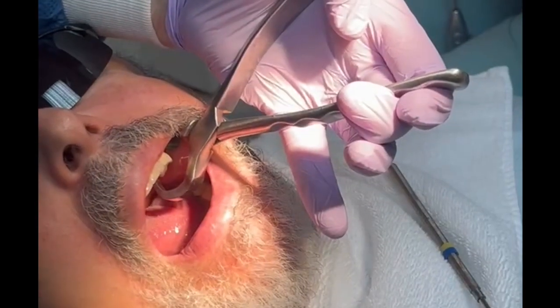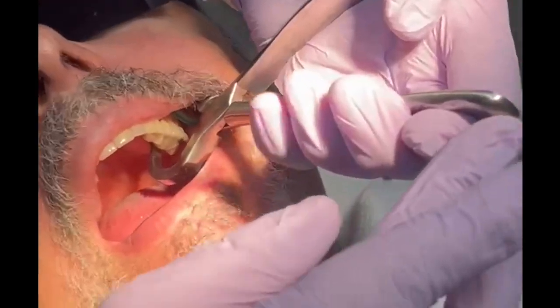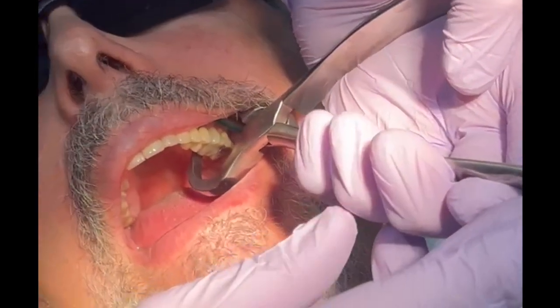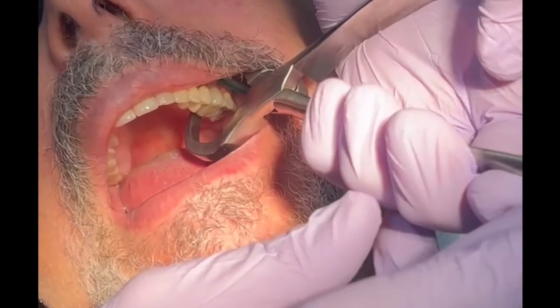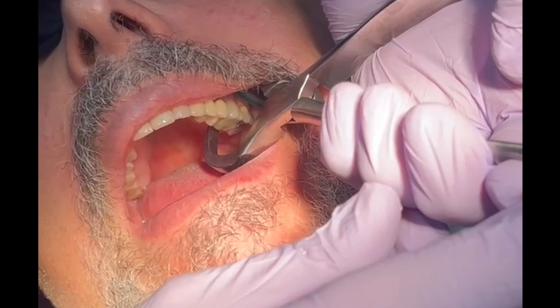Here I'm using the physics forceps, which consists of two components. The beak is a shovel-shaped edge, placed one to three millimeters subgingival on the palatal aspect, and the bumper is placed as high up the vestibule as possible.